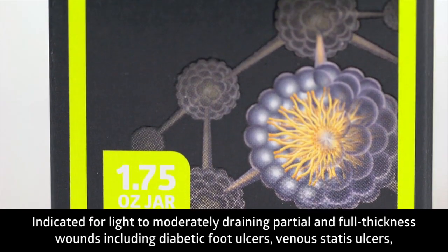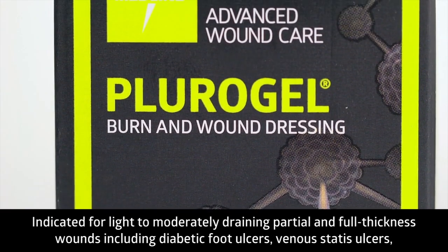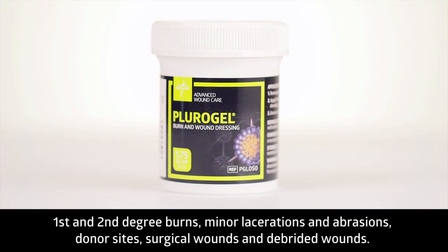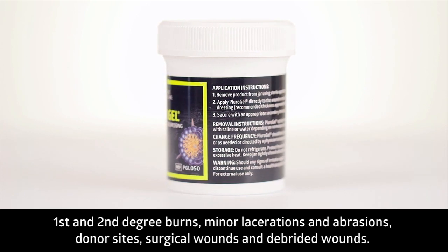PluroGel burn and wound dressing is indicated for use in light to moderately draining partial and full thickness wounds including diabetic foot ulcers, venous stasis ulcers, first to second degree burns, minor lacerations and abrasions, donor sites, surgical wounds, as well as debrided wounds.